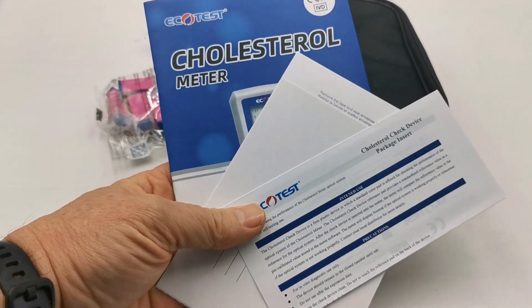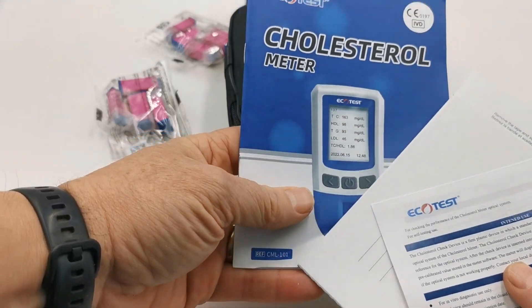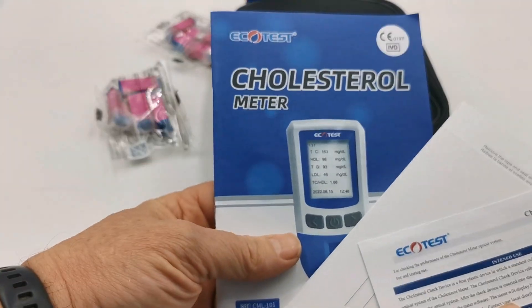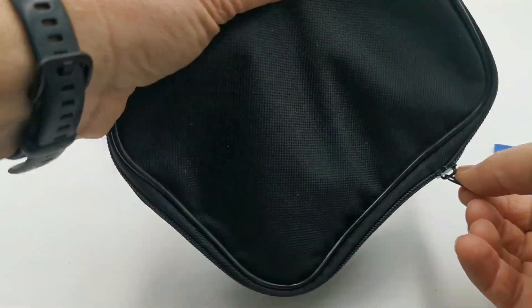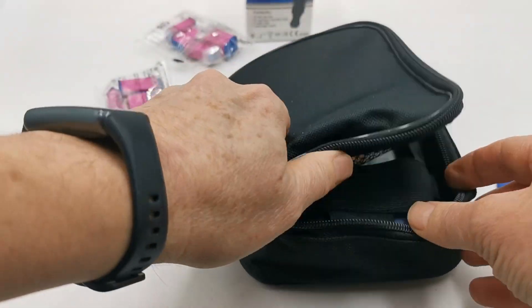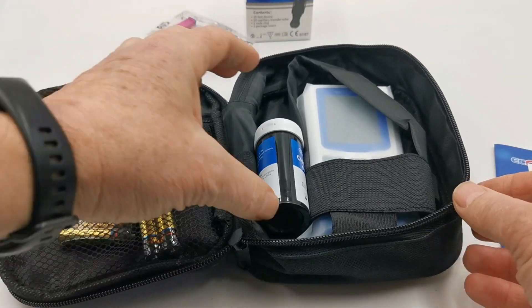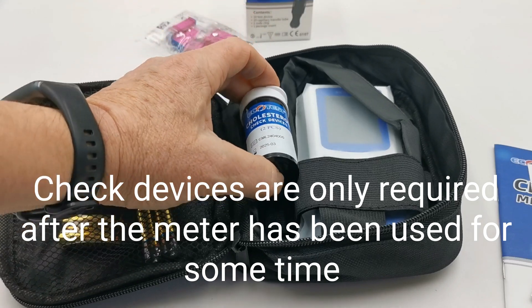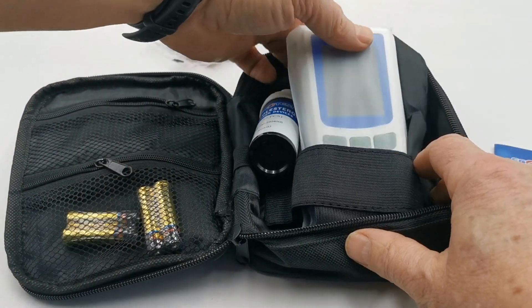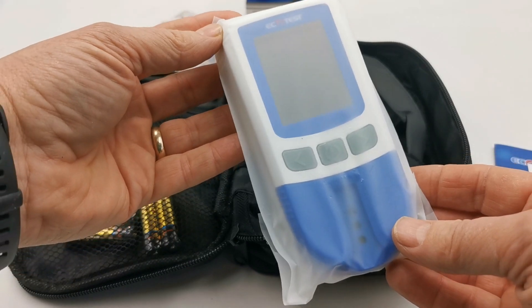Inside the pack when opened, you'll be supplied with a pack insert for the test devices, the cholesterol meter instructions, and then in this zip-cased storage compartment you will have four AAA batteries, a pack of two cholesterol check devices. These are check devices for the optical check on the meter, and then this is the digital meter itself.